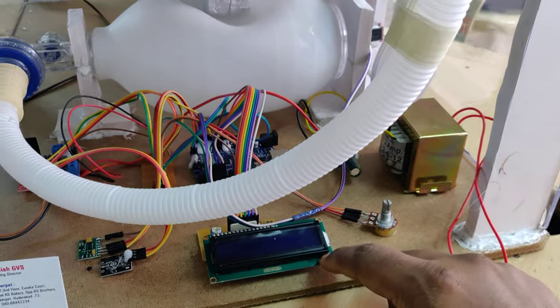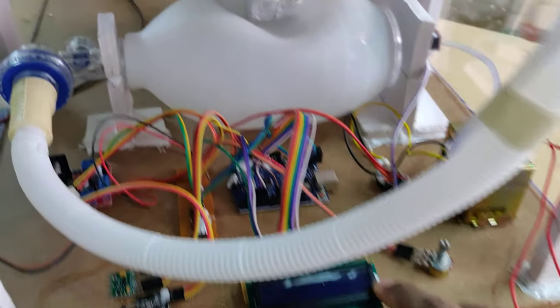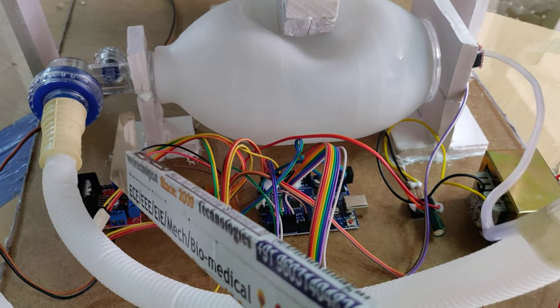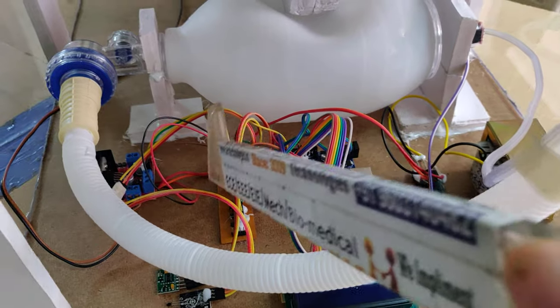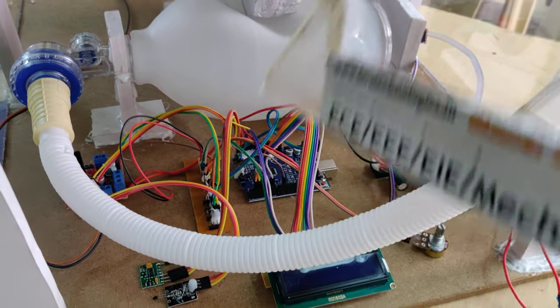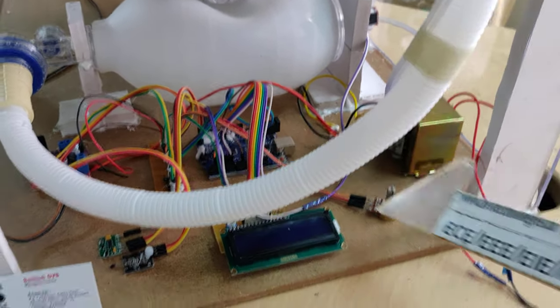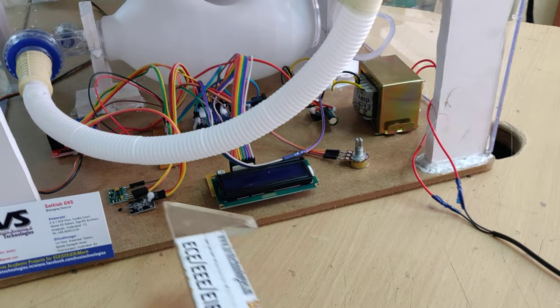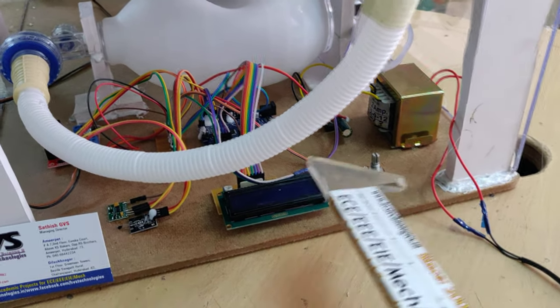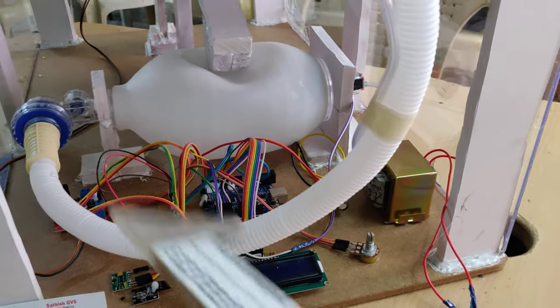The LCD is connected at pin number 2 to pin number 7, and the 10th pin is connected to the PWM output for this L298 motor driver. And this board is the breadboard to distribute the 5 volts power supply throughout the input and output modules along with the Arduino Uno board. Mainly in our project, the input modules are the MAX30100, the temperature sensor and the potentiometer. The output modules are the LCD screen as well as the L298 motor driver.